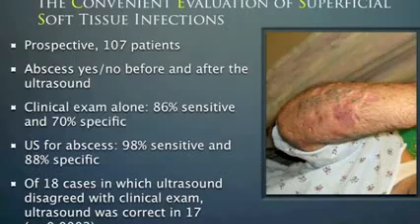One study, titled Abscess, Applied Bedside Sonography for the Convenient Evaluation of Superficial Soft Tissue Infections, was prospective and enrolled 107 patients. They forced the clinicians to answer yes or no before and after the ultrasound of whether or not they thought there was an abscess there.